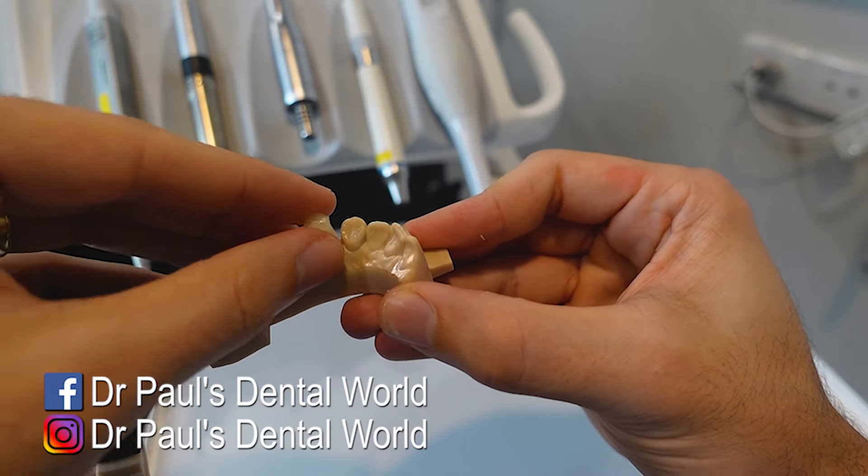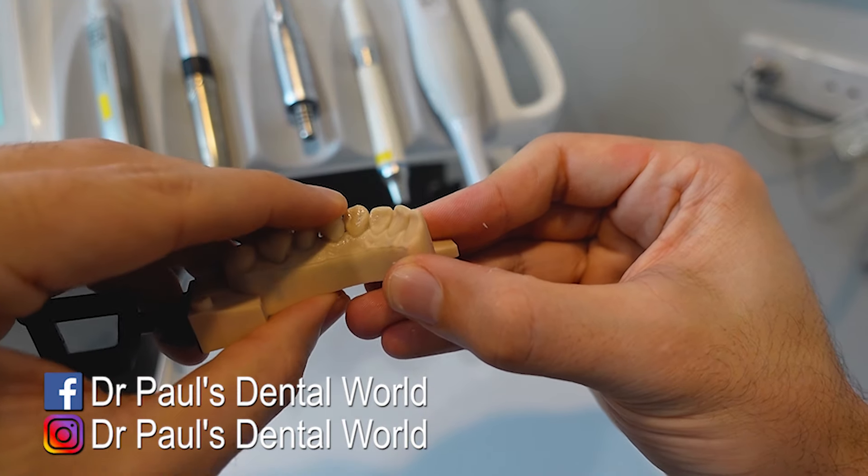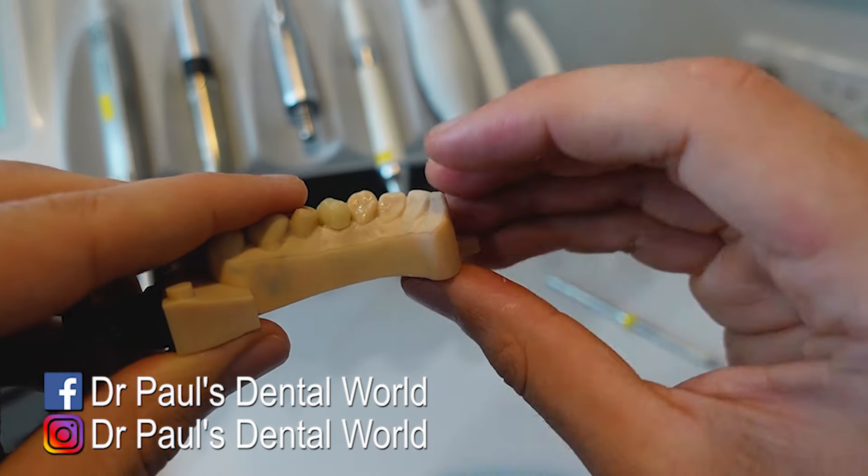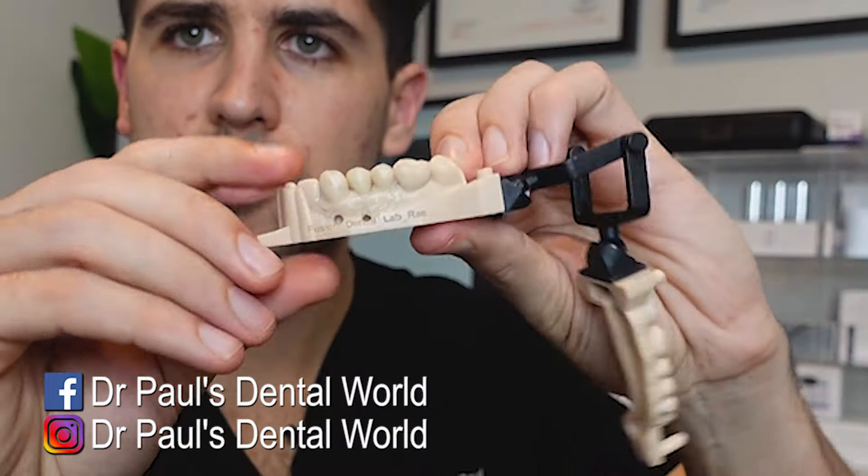So do it basically down towards the margin part, the apical portion of the crown. Okay, so now we'll try it on the model. That's fitting really nicely. Maybe a little bit over-contoured here, so we'd adjust that.